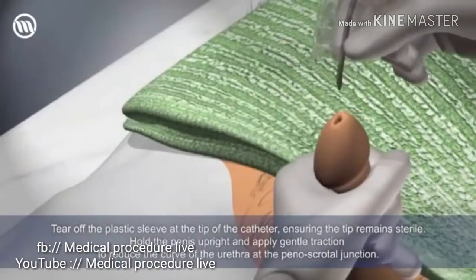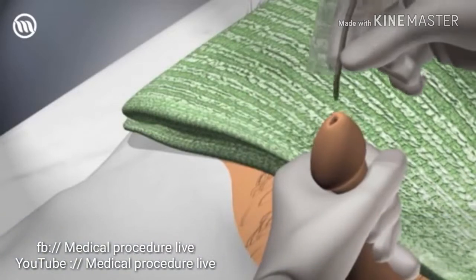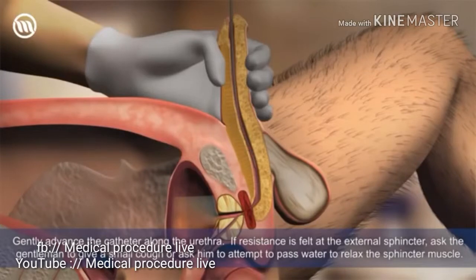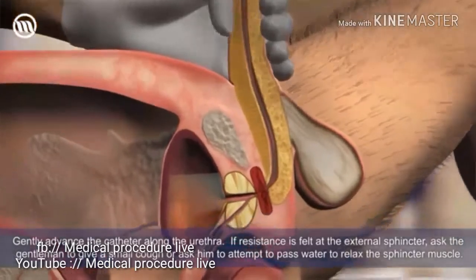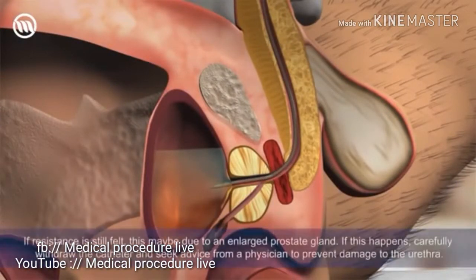Hold the penis upright and apply gentle traction to reduce the curve of the urethra at the penile scrotal junction. Gently advance the catheter along the urethra. If resistance is felt at the external sphincter, ask the gentleman to give a small cough or ask him to attempt to pass water to relax the sphincter muscle. If resistance is still felt, this may be due to an enlarged prostate gland. If this happens, carefully withdraw the catheter and seek advice from a physician to prevent damage to the urethra.